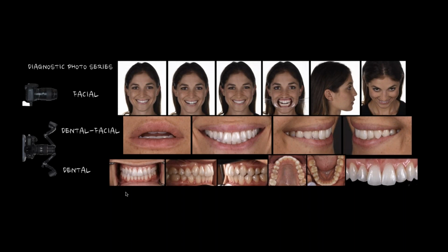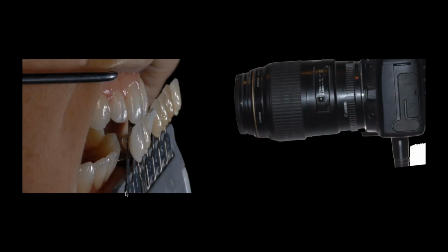After that, everything becomes about the dental, and the dental is really about retracted photographs. So I could take open mouth or closed mouth, left and right, occlusal planes, and black backgrounds. And these, I think it's, I don't know, 15 photographs here, if I counted them all, are the basic keys for me in every case that we work on. I don't touch a case until I have these photographs, and I'm not good enough to really evaluate my way through a case without seeing these basic photographic sections.